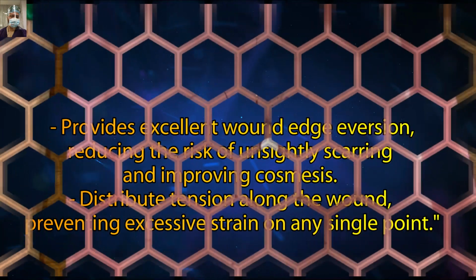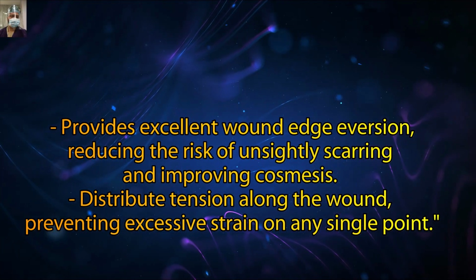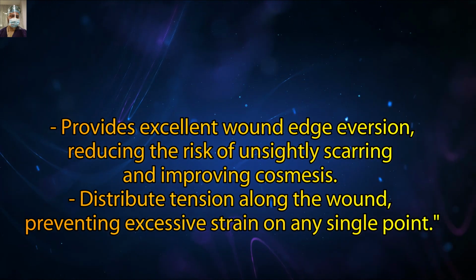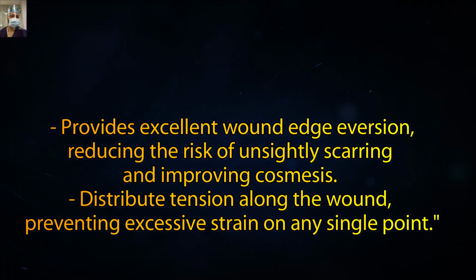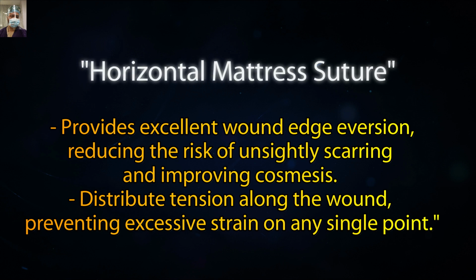So the next addition to your armamentarium will be the horizontal mattress suture. It provides excellent wound edge eversion, reducing the risk of unsightly scarring as your sutures are away from the wound margin, and improving cosmesis. It also distributes the tension along the wound, preventing excessive strain on any single point.